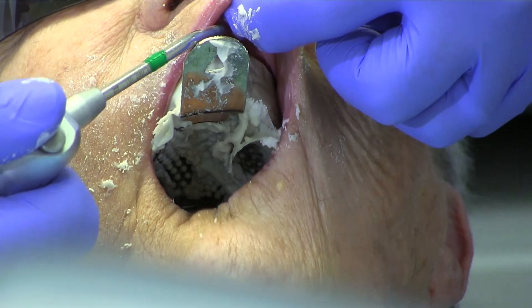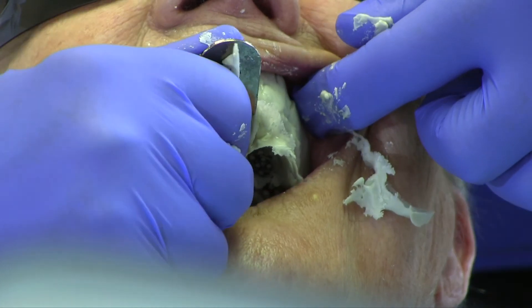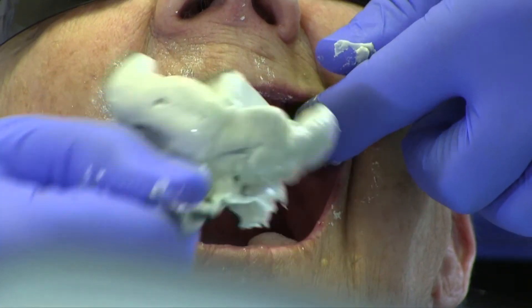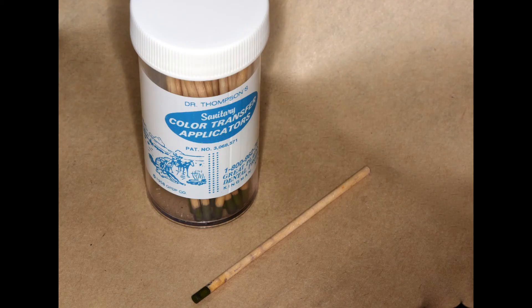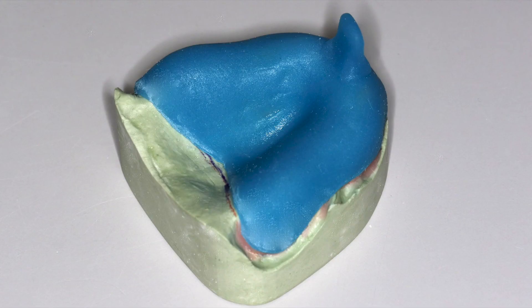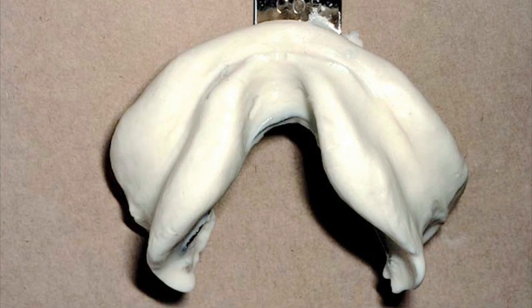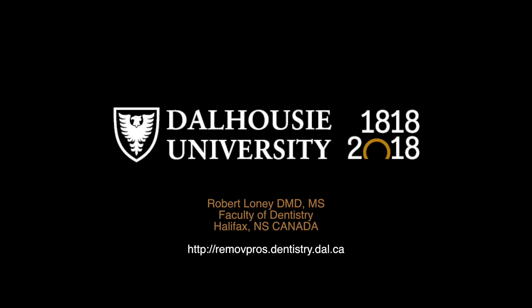To remove the impression, raise the lip, squirt a little bit of water at the periphery, wiggle the handle up and down until you hear the seal break, and then remove swiftly. Lastly, in the maxillary arch, use an indelible stick to mark the vibrating line. Reset the impression and the line will transfer to the alginate impression. In turn, this will transfer to the diagnostic cast and help determine where to end a custom tray. A preliminary impression is an important first step to making a good denture.